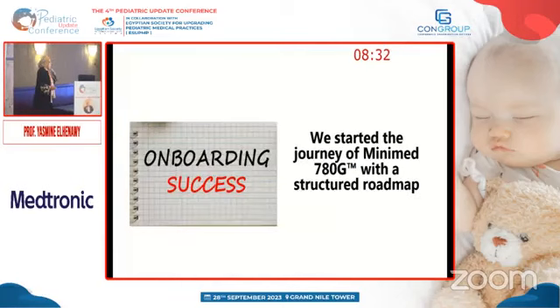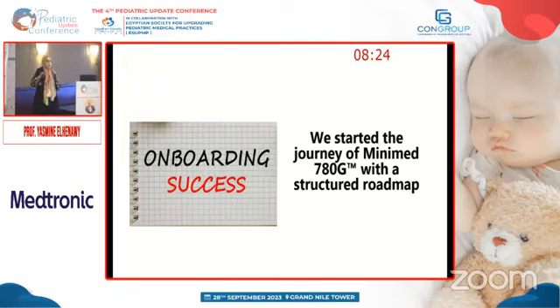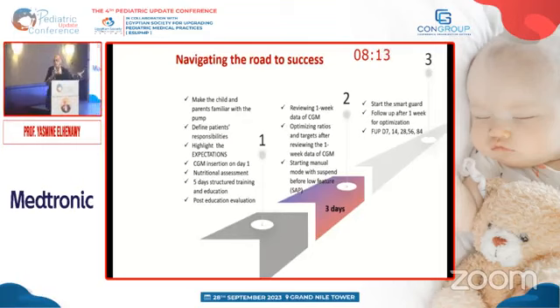طيب هو احنا فعلا الريزلتس بتاعتنا في ايجيبت ار فيري بروميسنج، والريزلتس دي كانت بروميسنج عشان احنا دايما وي ار فولوينج a structured road map for initiation of the pump. هو الرود ماب ده اللي وصلنا للسيف فاينل ديستنيشن. طب ليتس كده نافيجيت ذا رود توجذر. هو سمبلي 3 ستيبس.